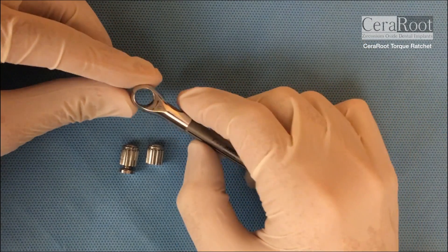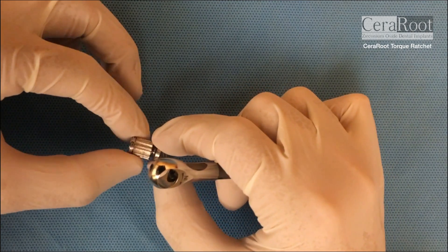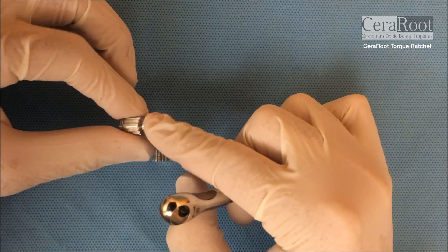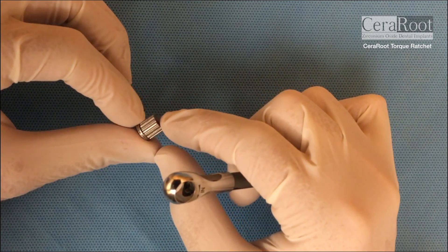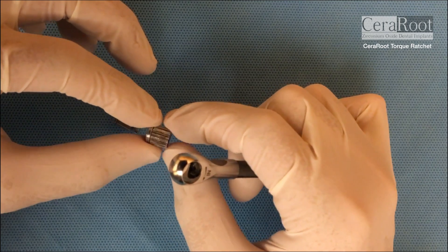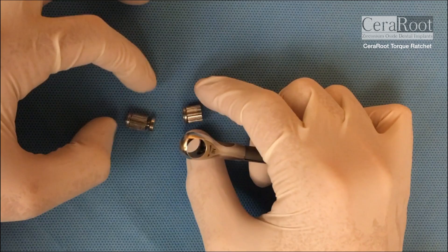So you have two thumbwheels — one with a disc to rest the finger on top of it, and one shorter especially for the distal regions. For molar areas you need more space, so sometimes this shorter one will be nice.